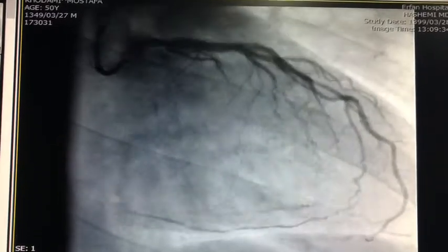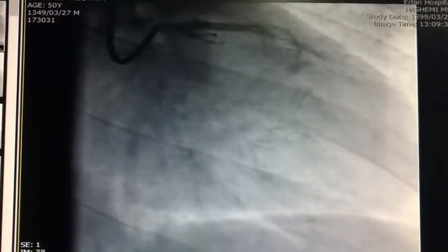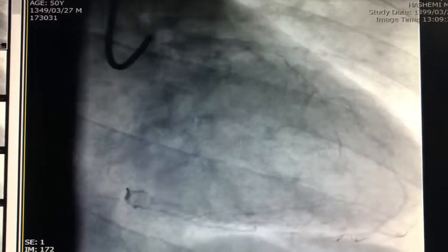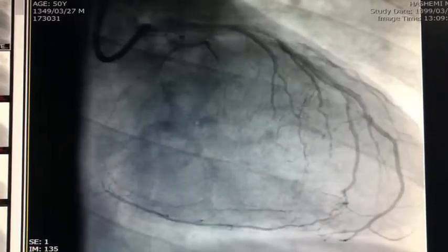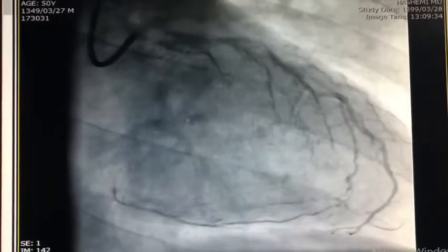The case was done in collaboration with Dr. Arsis Ahmadiye. The patient is a 50-year-old male with a history of two-vessel disease, a significant lesion in the ramus which was fixed with stenting in another session, and an RCA CTO with a JCTO score above 4, from the ostioproximal part, with heavy calcification, an ambiguous proximal cap, and a long CTO lesion. The first MRI viability study showed ischemic myocardium in the RCA territory, and the patient was scheduled for a primary retrograde approach.